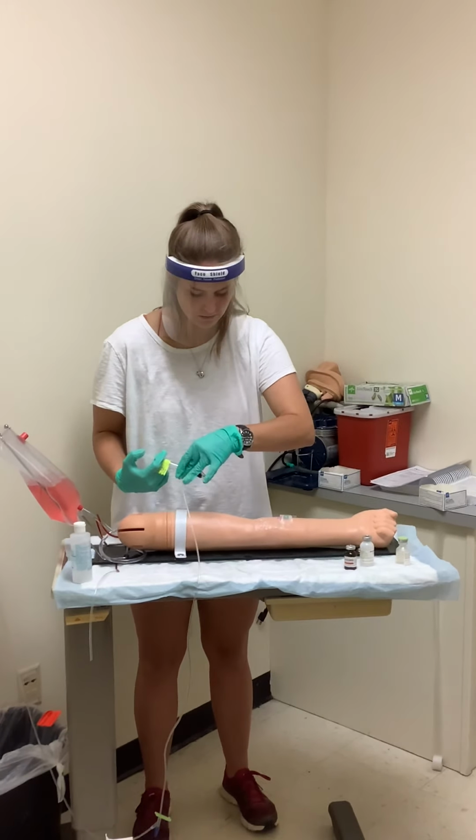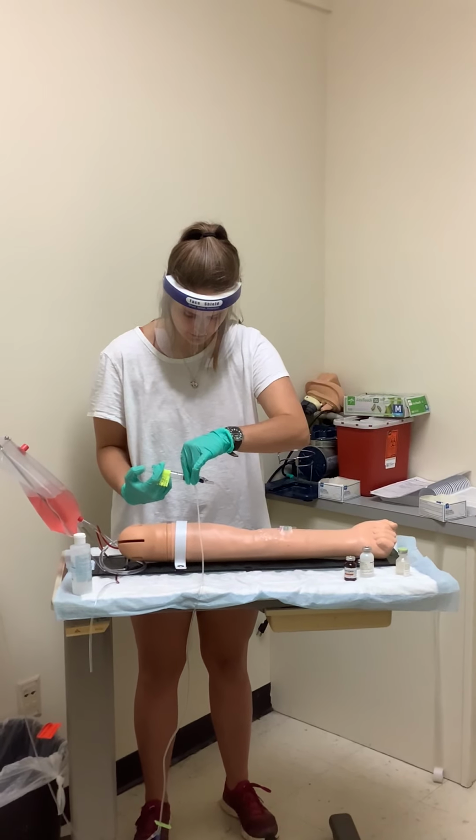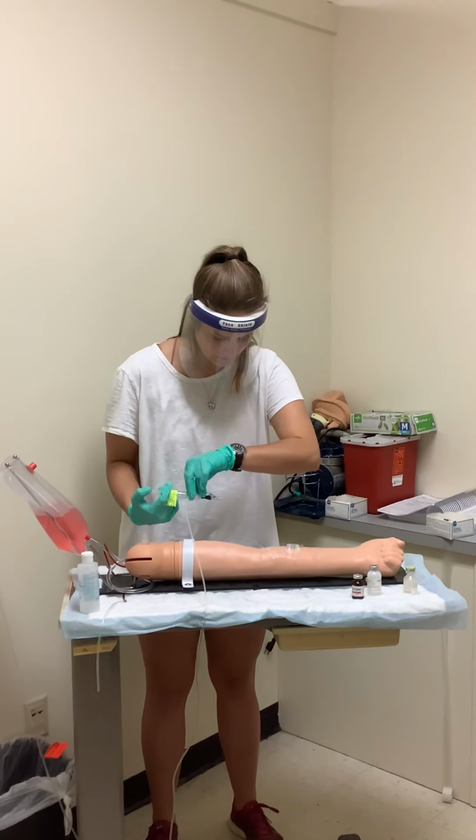And I can pinch and give my second milliliter. And I'll let that go.